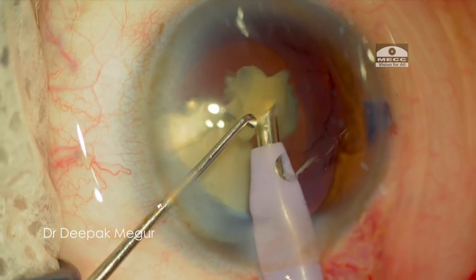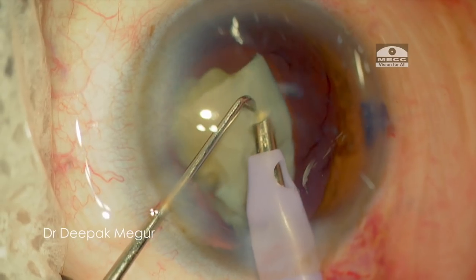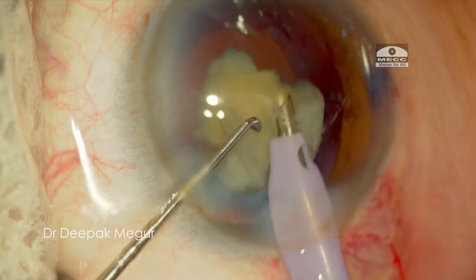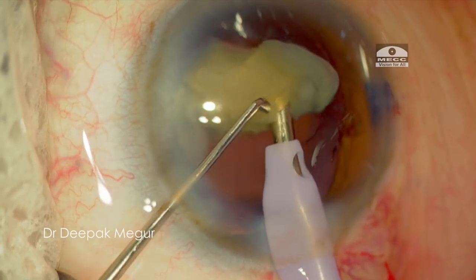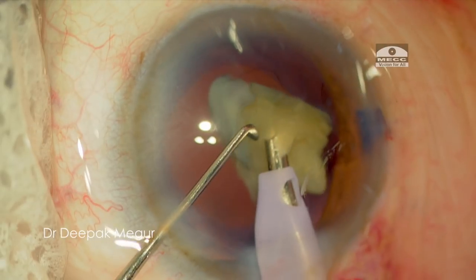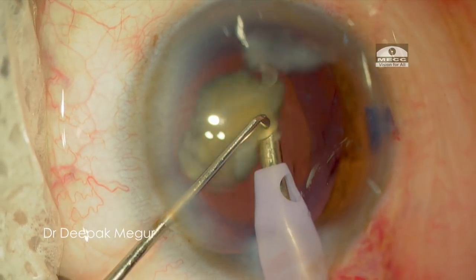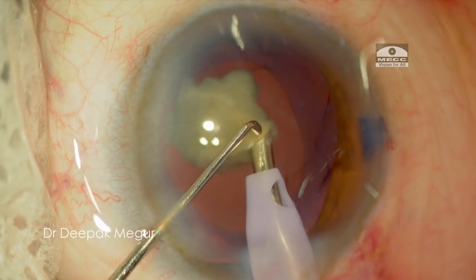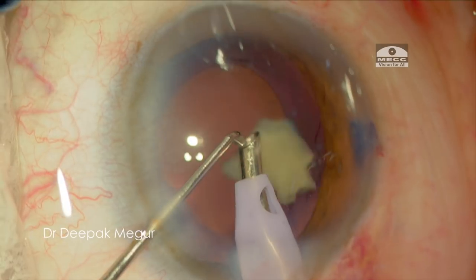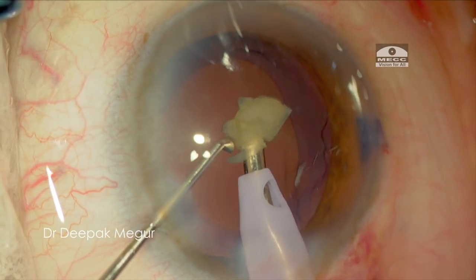Moving on, while emulsifying the fragment, I want to ensure that my plane of emulsification is not too anterior. The visual clue I follow is that some part of the nucleus has to be touching the anterior capsule as it is dancing around the phaco tip during emulsification. This clue ensures me that I'm not too anterior — my plane of phaco emulsification is probably at the iris level or at the level of the anterior capsule.